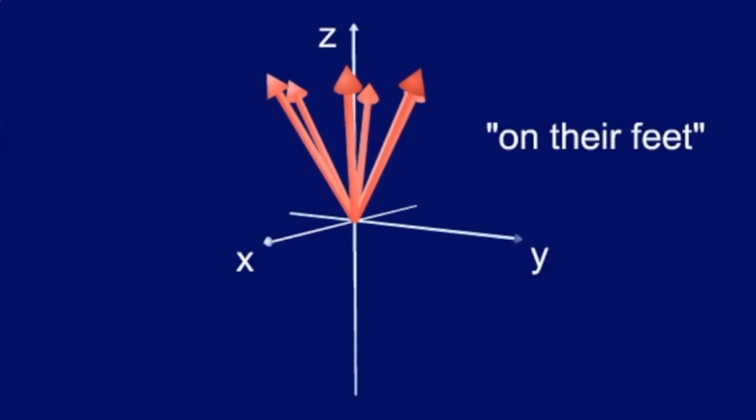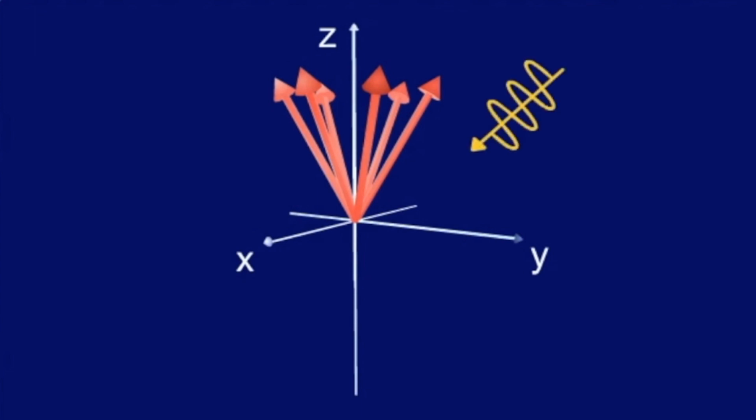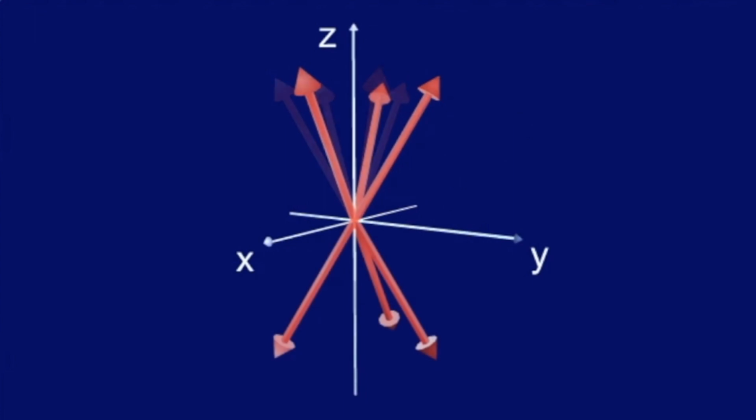Let's have a closer look at what happens. Sending in the RF pulse makes, let's say, 3 protons walk on their hands. Note that for simplicity, the protons were not depicted as being in phase. This subject is covered in more detail in sections 12 and 16.